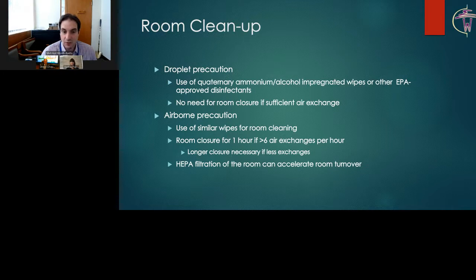There's no need for room closure if there's sufficient air exchange for droplet precaution. And air exchange really depends on a number of factors. It depends on room size, room ventilation, and air circulation within that room. For airborne precaution, we use the similar wipes for room cleaning. And we close the room for 1 hour if there's greater than six air exchanges per hour. If it's a lot more than six air exchanges, you can close it for less than an hour. If there's less than six air exchanges, you probably need to close it for longer than an hour.